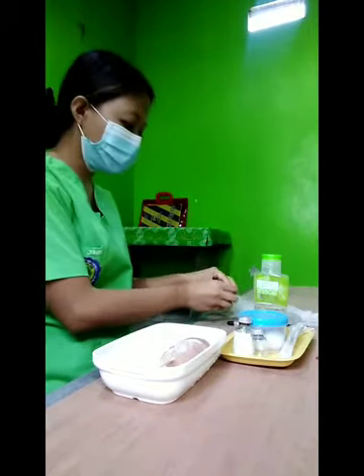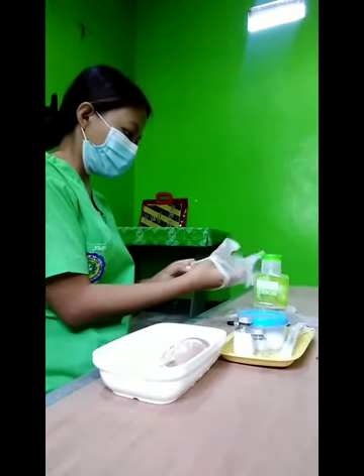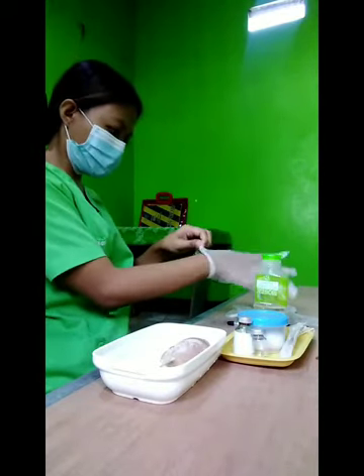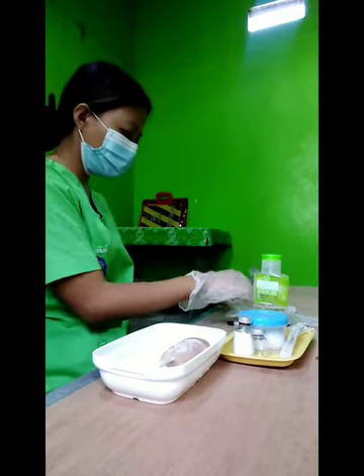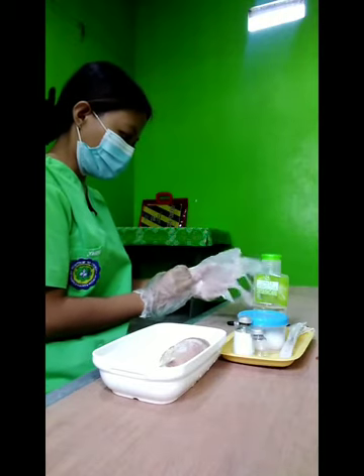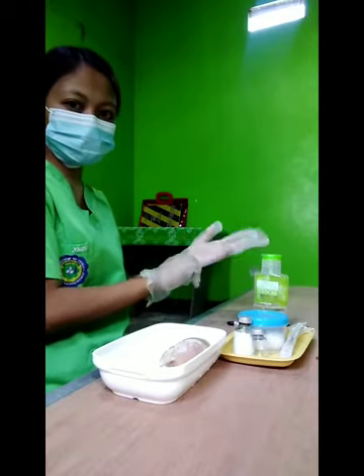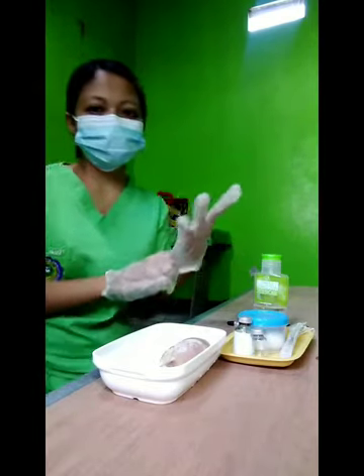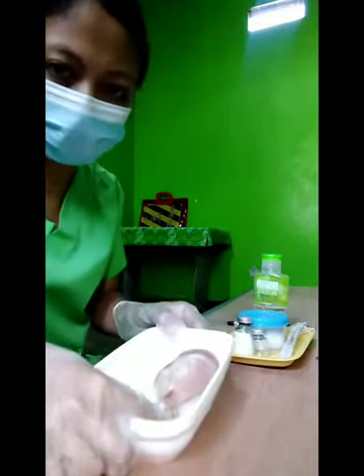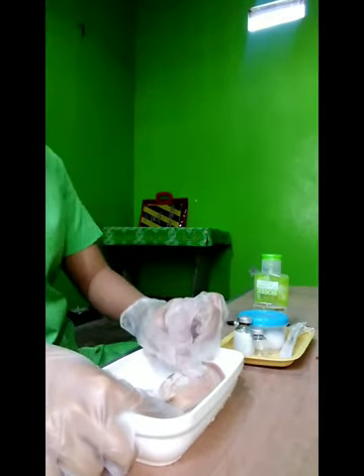Then, put on gloves. Then select the appropriate administration site.